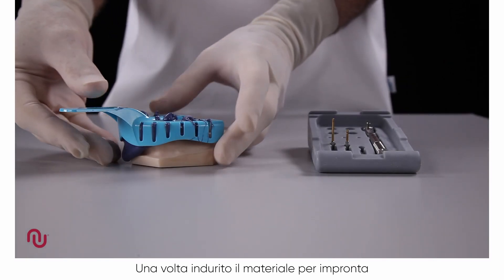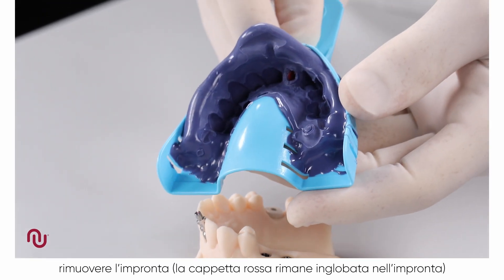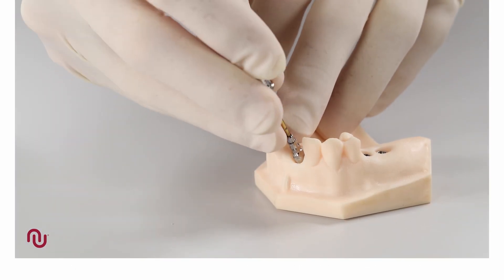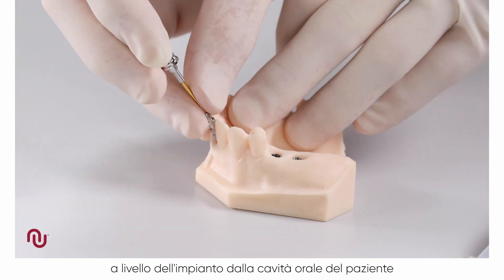When the impression material has set, remove the impression. The red plastic impression cap is picked up in the impression. Using the screwdriver, unscrew and remove the implant level impression coping from the patient.